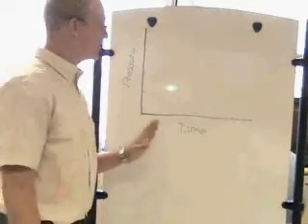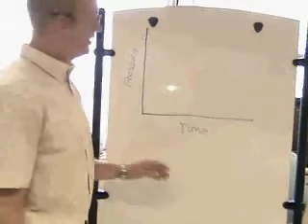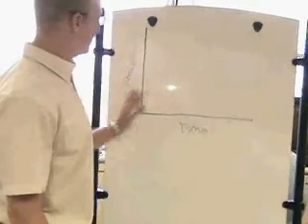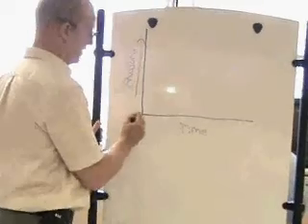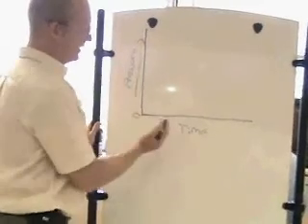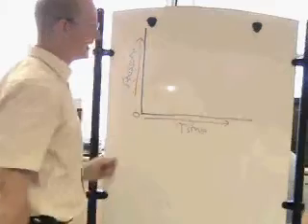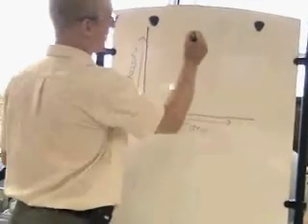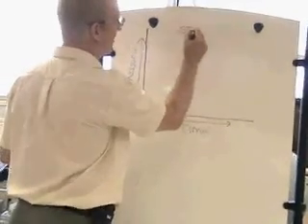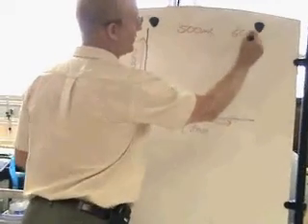Okay, well, we're going to talk today a little bit about volume ventilation and looking at a pressure time scaler. What I've drawn so far is pressure on this axis, which obviously starts at 0 and then increases as we go up, and time on the other axis, which obviously starts at 0 and goes up this way. When you look at volume ventilation, for this example, we have a 500 milliliter breath, and we're going to be pushing that breath in at 60 liters per minute.